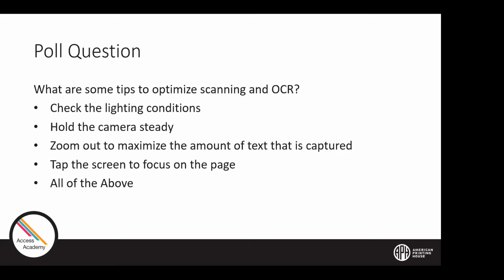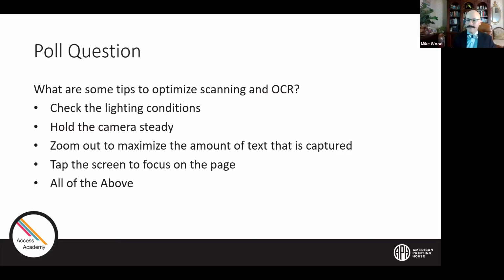All right. We did have one question come in from Dorothy. How is this device different from the Ruby 10? I'm using this with the student and the devices seem very similar. It's a great question, Dorothy. Do you want me to take that one, Justine?